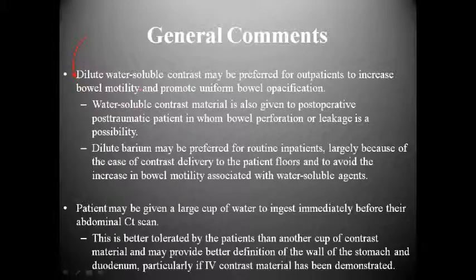She drank it, and actually, when I scanned her, she had a bowel perforation. And so, if I had used dilute barium, it would have made a horrible mess, and it could have gotten nasty very quick. But because it's water soluble, there was really nothing to be worried about there, because basically it'll just be absorbed back into the patient's body. And so there's a lot less to actually worry about here.